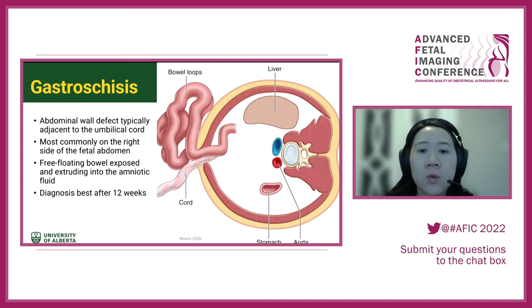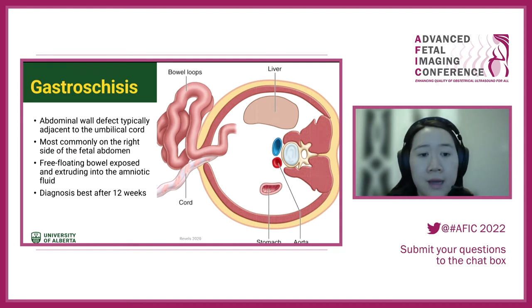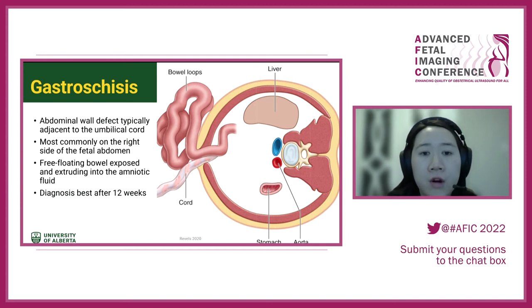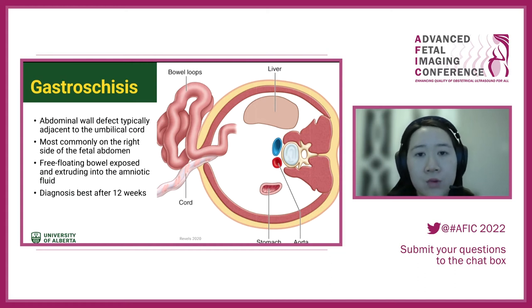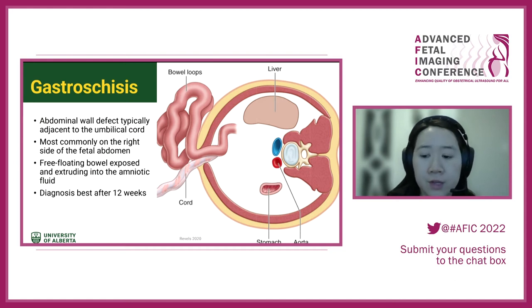Gastroschisis: we're looking for a defect typically on the right side of the umbilical cord insertion. Scanning down to the level of the umbilical cord insertion, we can see free-floating bowel loops outside. The diagnosis can be overcalled before 12 weeks due to physiologic gut herniation, so it's best confirmed after 12 weeks.